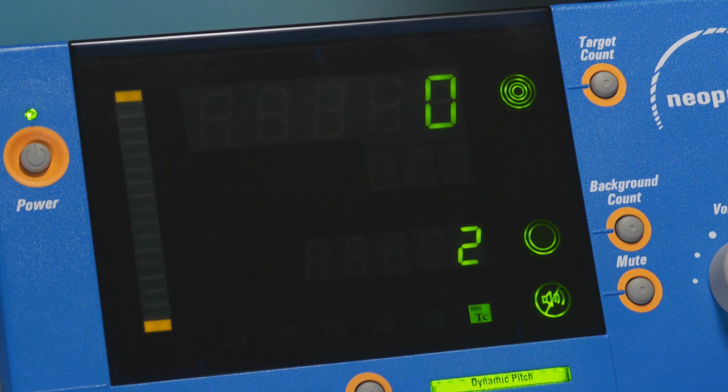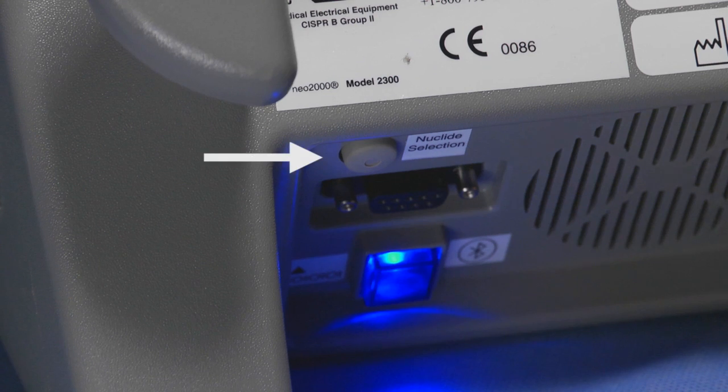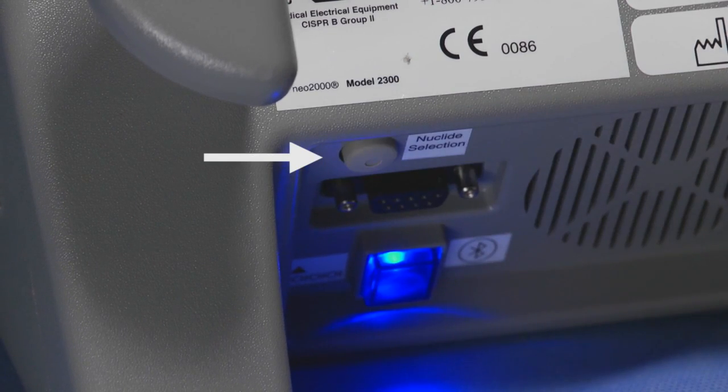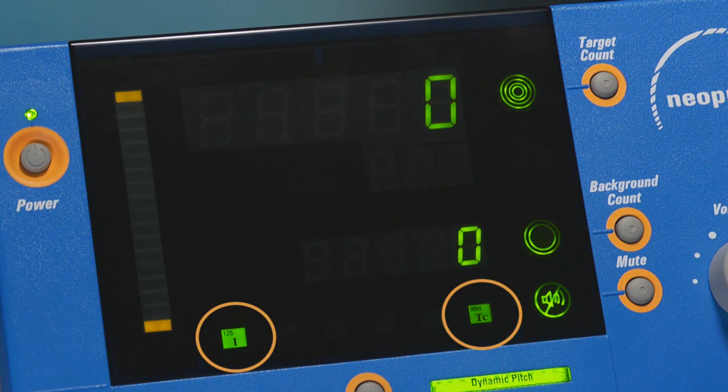Dual isotope mode is selected by pressing the radionuclide button on the rear of the unit once. Both I-125 and Tech-99 radionuclide indicators are illuminated.